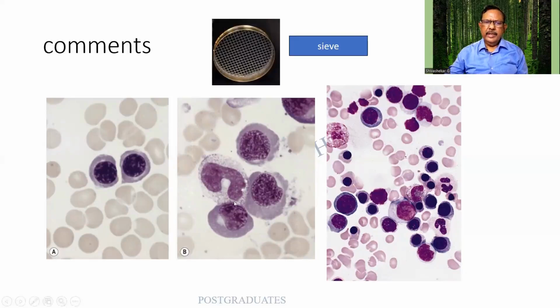Again, you are seeing a giant stab form over here. It can be larger even than the other cells, larger than the myelocyte. So it is called a giant stab. In spite of such active hematopoiesis and erythropoiesis, you find that the patient will be having an anemia because of dyserythropoiesis. It is not able to survive its entire term, and there will be a milder degree of hemolysis.